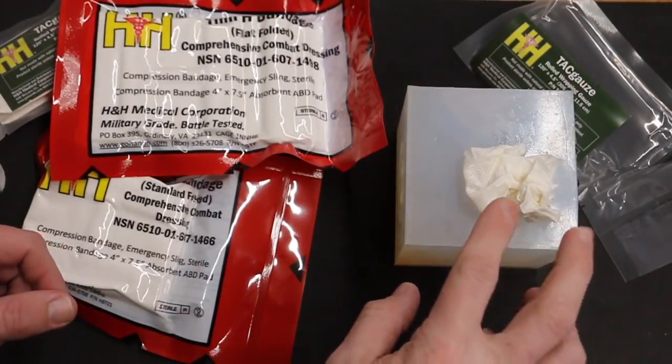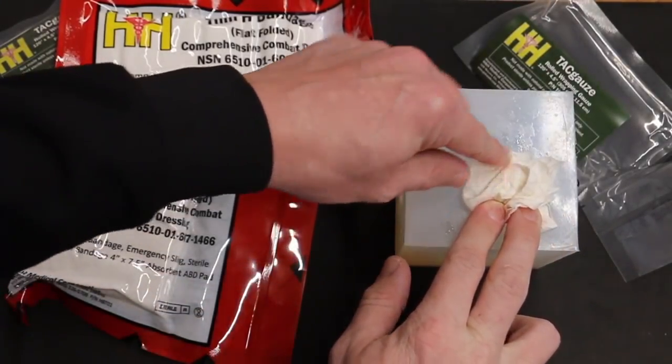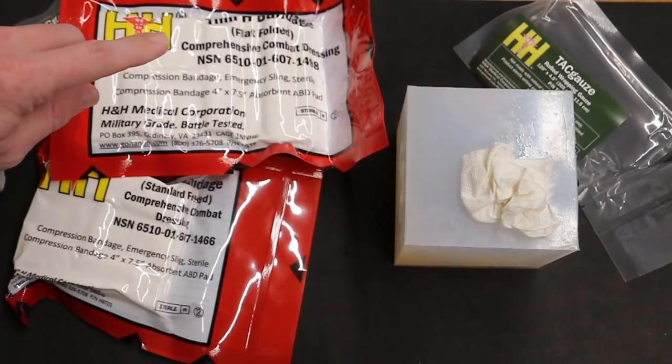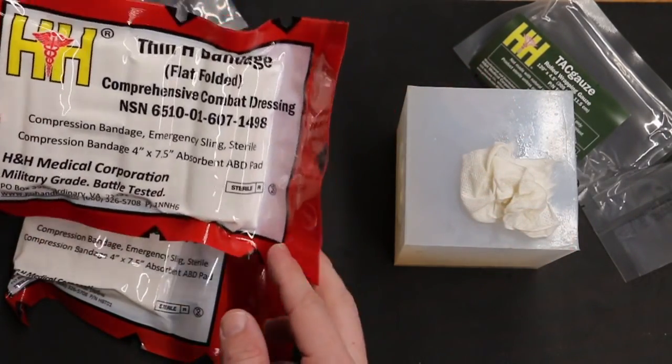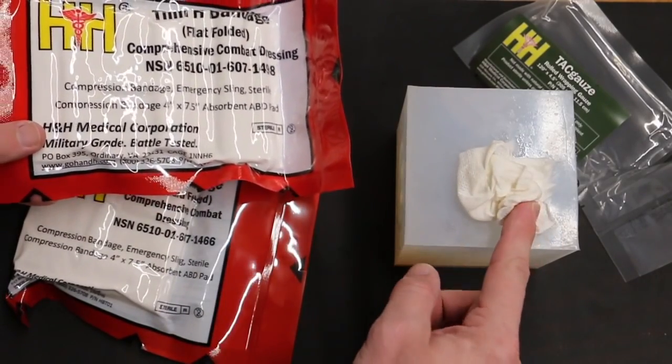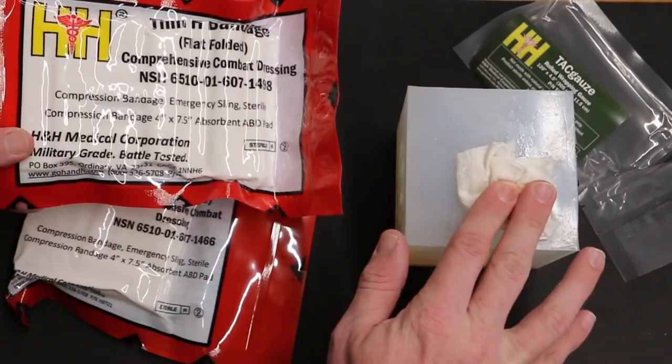After you've held pressure for about five to ten minutes and you don't have any more blood coming around the hole, you know you've got bleeding controlled. You could then use an H&H compression bandage — either a flat fold or the standard fold — to wrap around the limb and hold pressure for you.